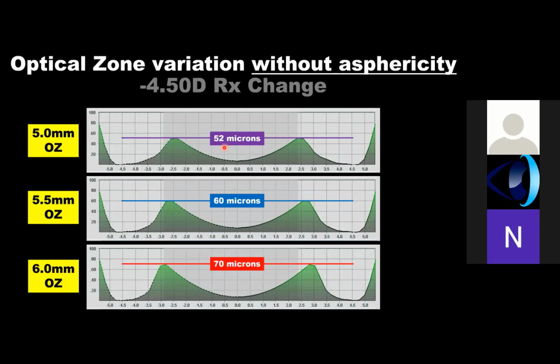And when I say dramatic changes, I mean kind of that shrinking of treatment zone size by maintaining the fluid, what's the word I'm looking for? The forces? Yeah, the forces, exactly. Hydraulic forces. Thank you. It's like you said earlier, past my bedtime, so my brain's trying to remember the words at this point.